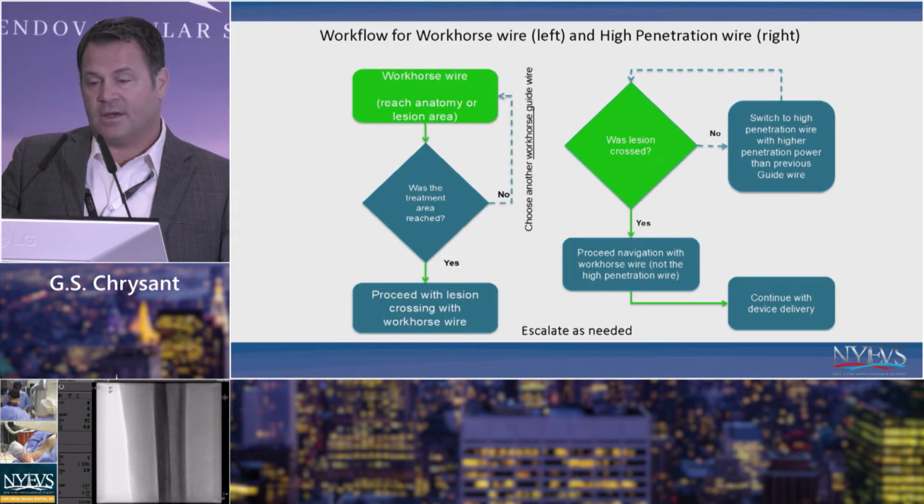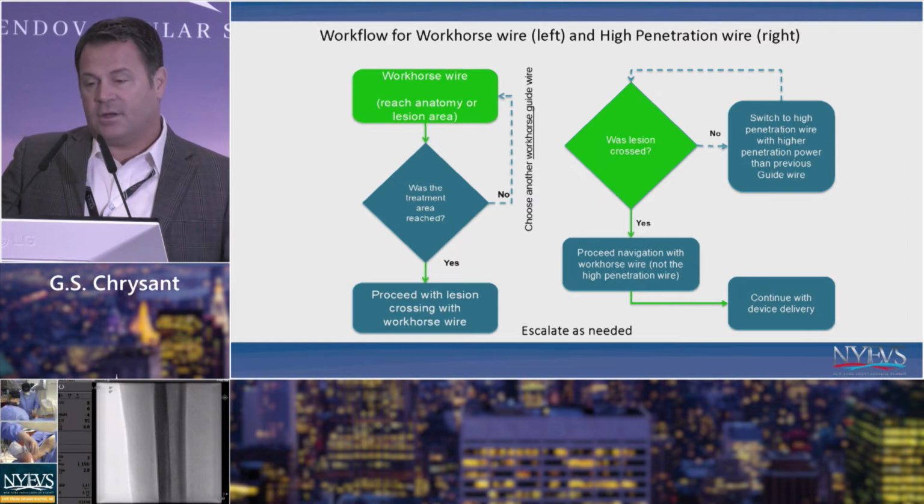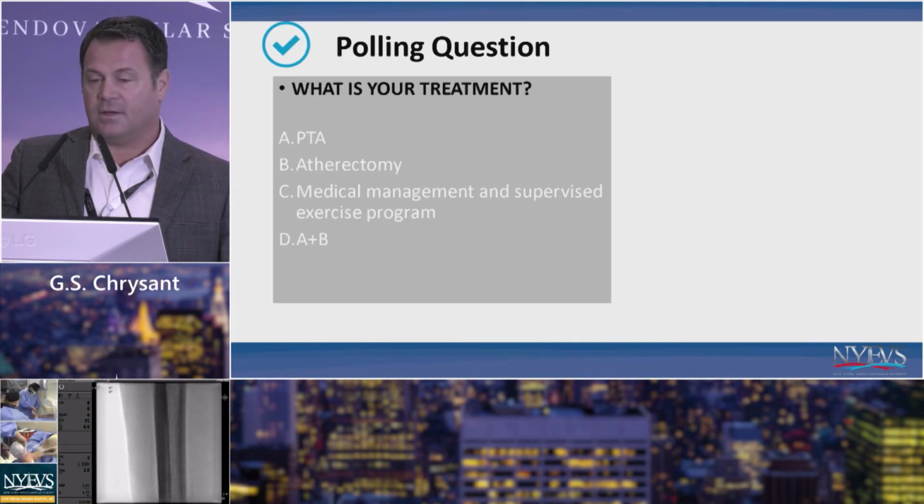And then a basic algorithm is just, I like to start with a workhorse wire. I mean, why make things hard on yourself? A lot of times your workhorse wire will work. So if it works, great. If it's not, choose another wire. If you know you're up against a very difficult lesion, then you're going to need a higher penetration wire. Same thing. So pick one that you're very comfortable with, start with that, and then escalate as needed.